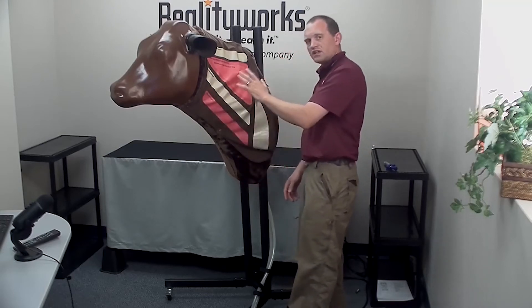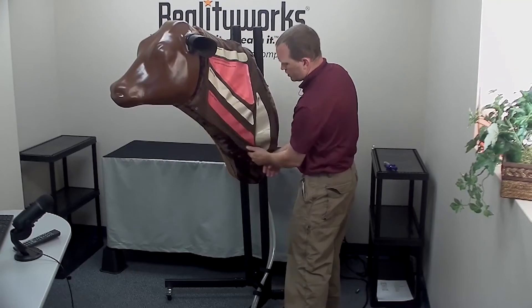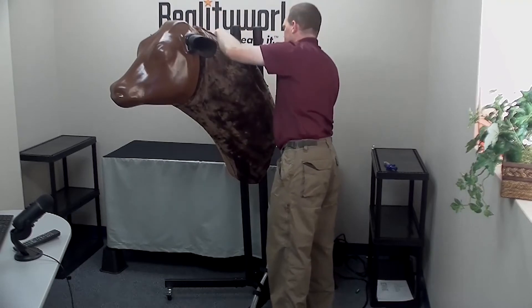Do not stick any needles into this cover — it is just for location purposes. You'll want to remove it; you can either take it off completely or just drape it over to the other side.